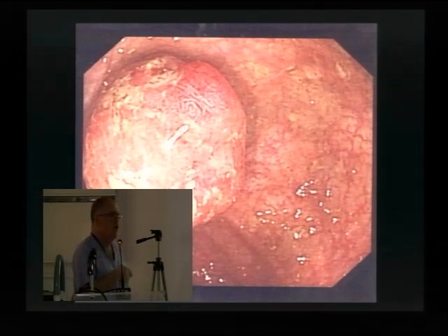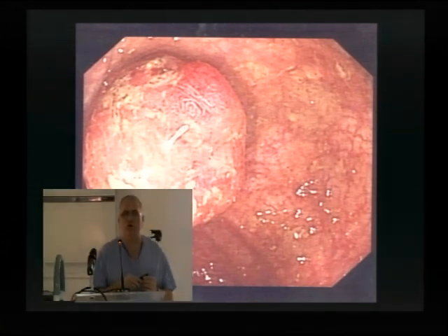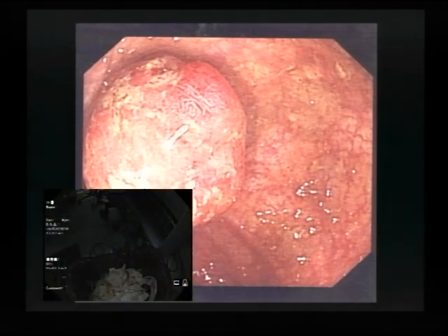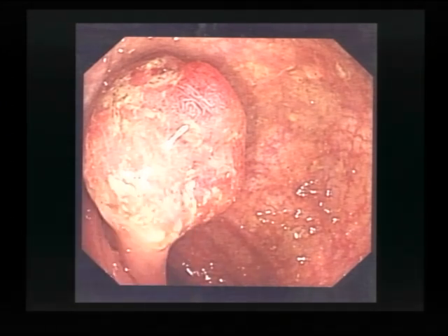Okay. Is anybody aware of a polyp assessment tool that enables you to understand how this polyp would be safe to take off? To give it a classification, because you guys like to work towards classifications. Is there a classification that you can use that will actually enable you to understand how safe or unsafe this polyp is to take off?